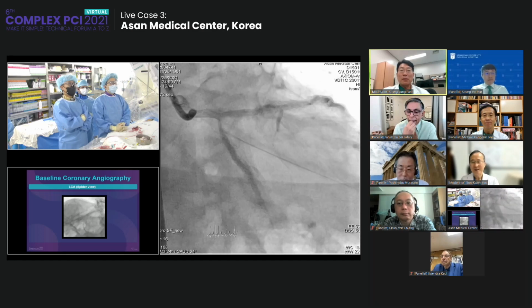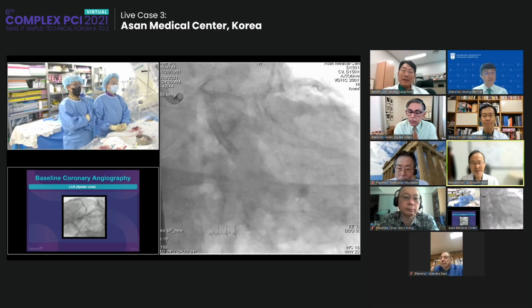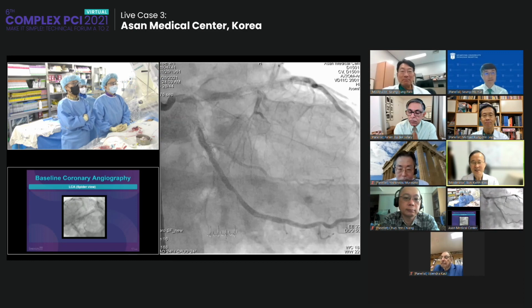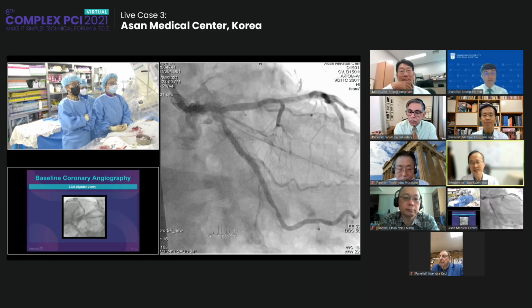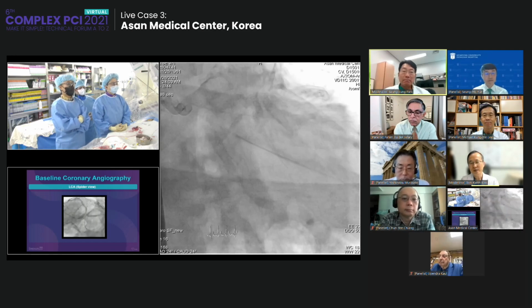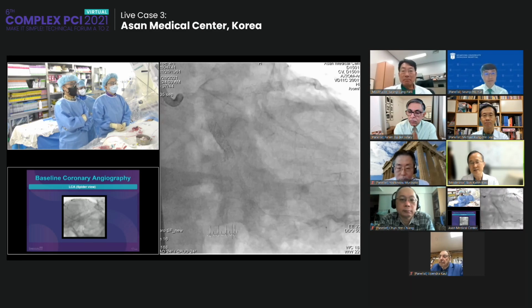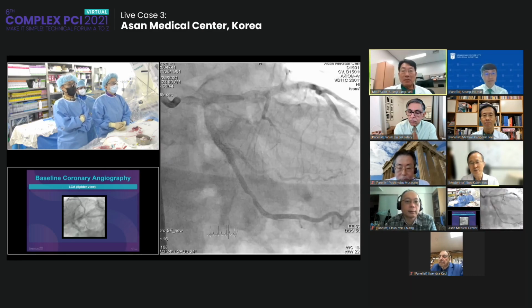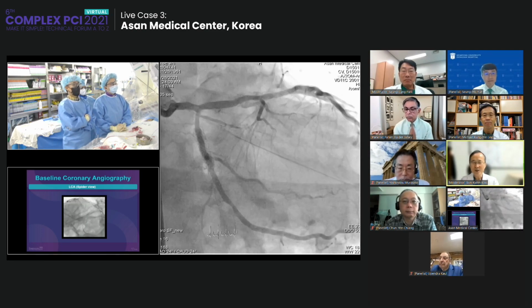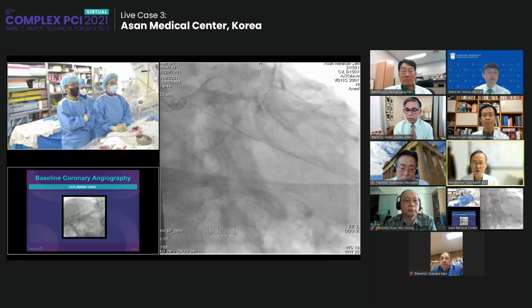So I would say that it's a real intermediate left main disease. And so I would also start the measurement of FFR first. There's a possibility that the FFR in LAD is lower than circumflex FFR. And there's a diffuse step up at the distal to proximal, and some additional step up at the distal left main. And the circumflex would be a little bit borderline, around 0.78 or so. But there should be some big step up at the proximal circumflex ostium to the left main.